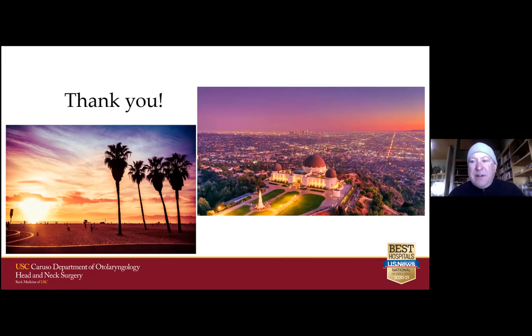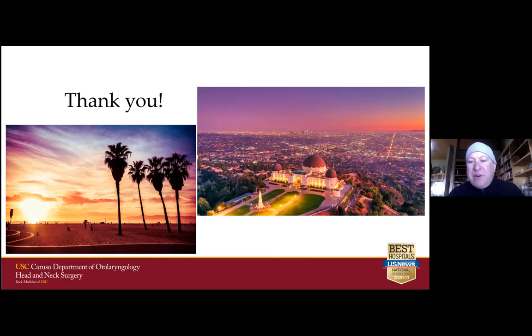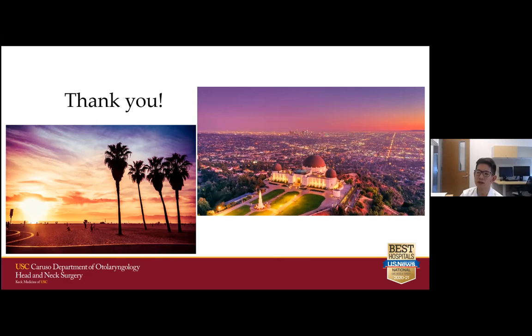Do you ever lose turbinates with coblation? In other words, do they ever necrose and literally fall off? No, I've never seen that before. It's such a small area that's vaporized, and I've never seen it penetrate the mucosa. It's always submucosal. So I've never seen necrosis of the turbinate, because usually the vasculature of the inferior turbinate runs on the inside, and when you do the coblation, you're on the lateral aspect of the inferior turbinate. So I think it's very rare to injure the vasculature and cause necrosis.